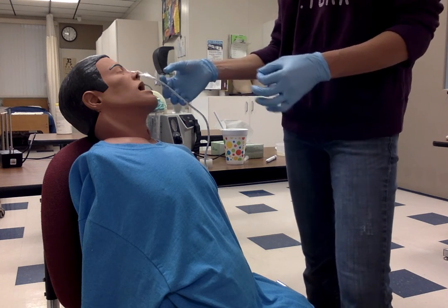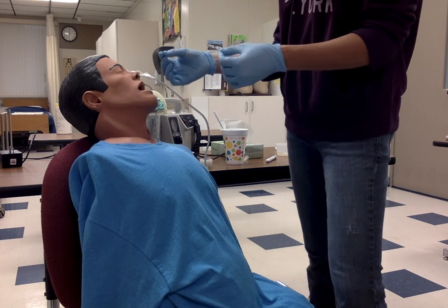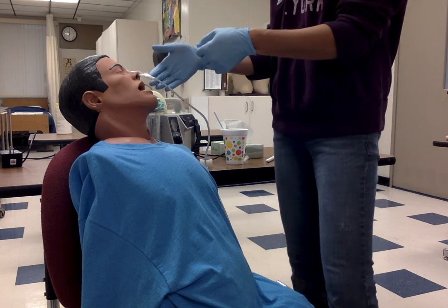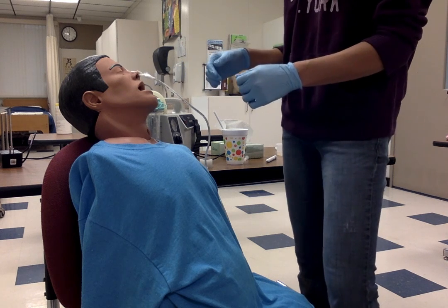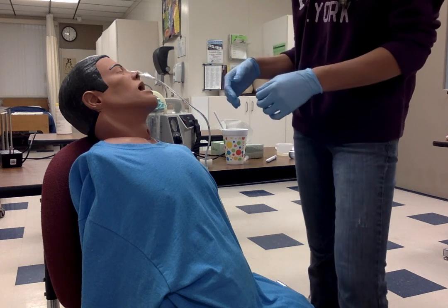You can, at that point, remove it, take it out. This is not a sterile procedure. So if you want, you can try the other nostril if there are no contraindications. And you can try using that same tube. You don't need to go and get a new tube. So that would be something that you would want to check if you're having problems.